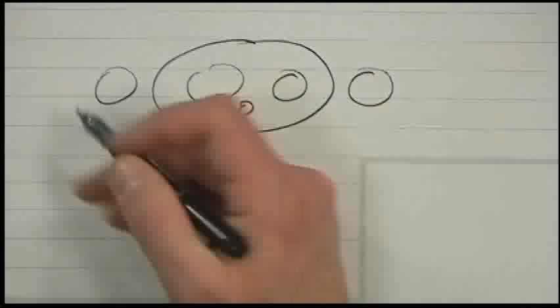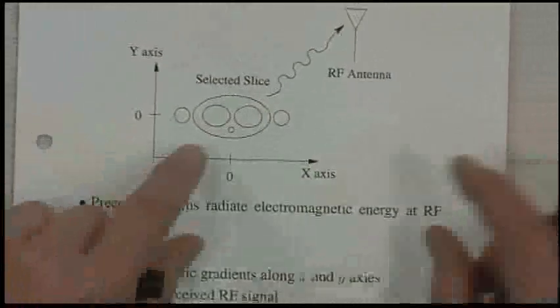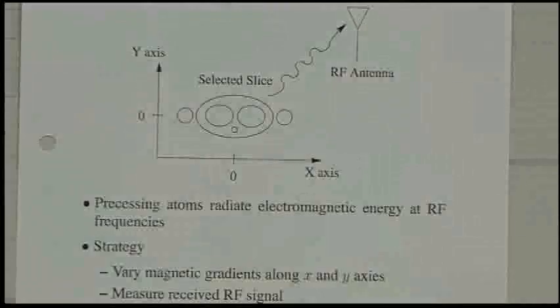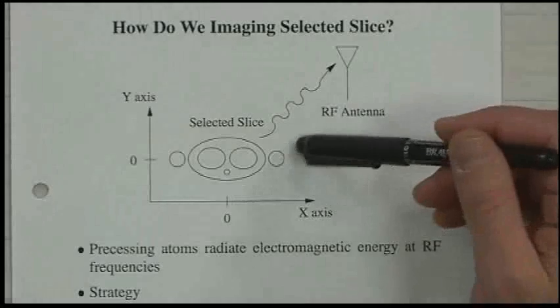But you have to slice them through the middle, okay? So if you slice a person, they kind of look like that, right? Because those are the two lungs, and that's the backbone, and that's their arms, okay? So actually, if you look at enough of these, it becomes natural. It's a little freaky, but... Okay, anyway, so this is what it looks like.